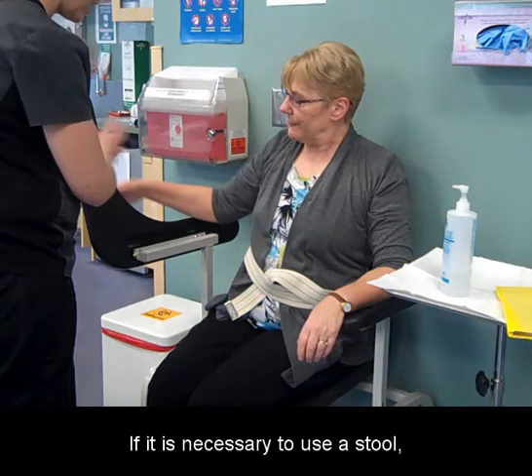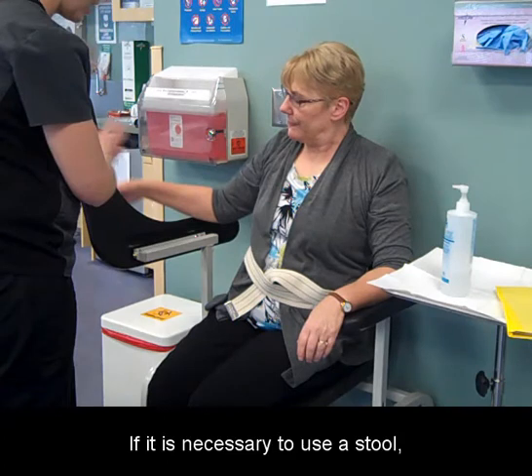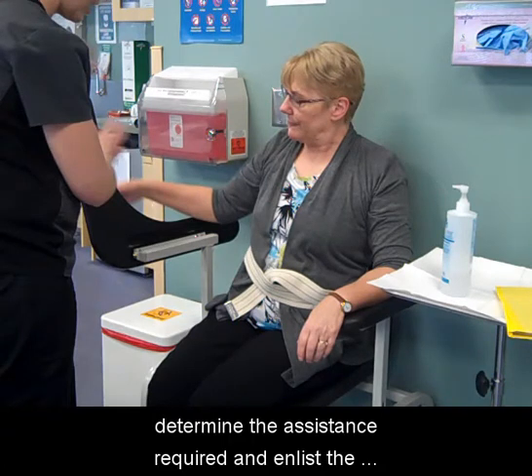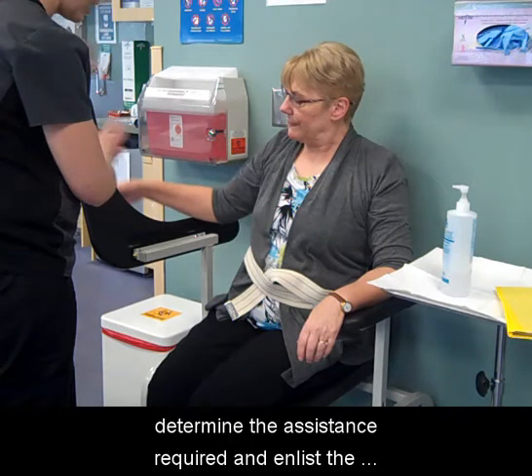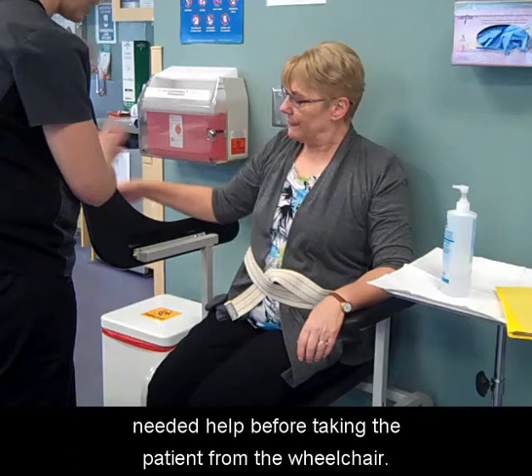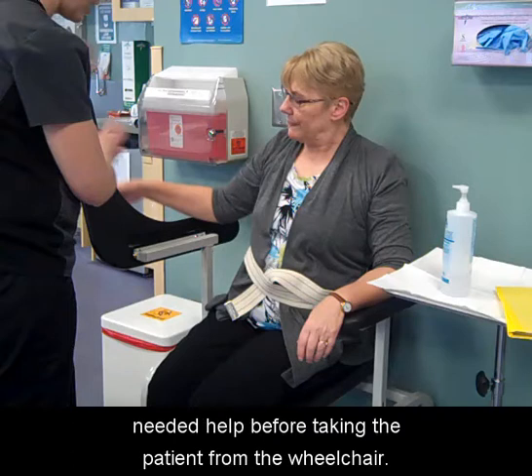If it is necessary to use a stool, determine the assistance required and enlist the needed help before taking the patient from the wheelchair.